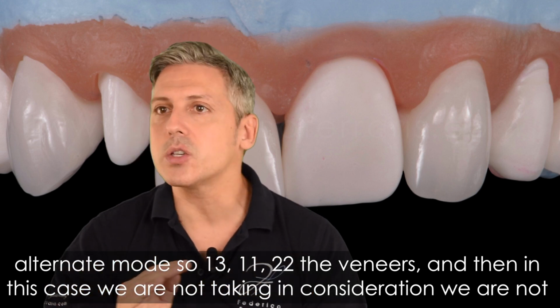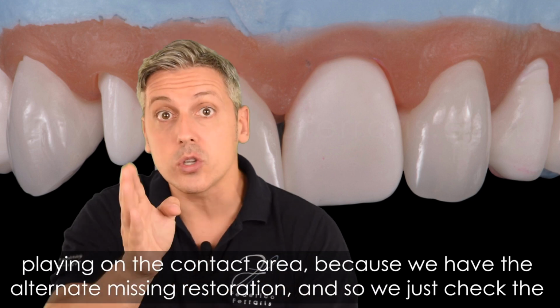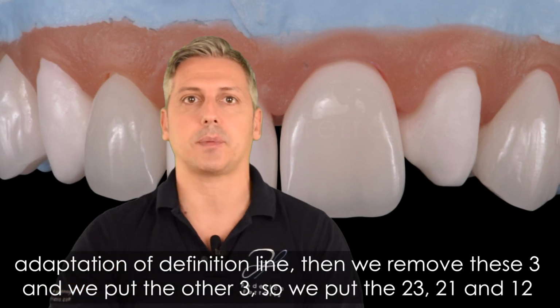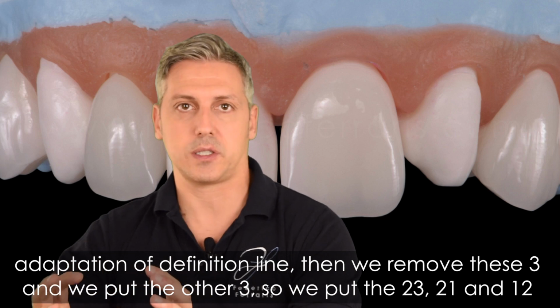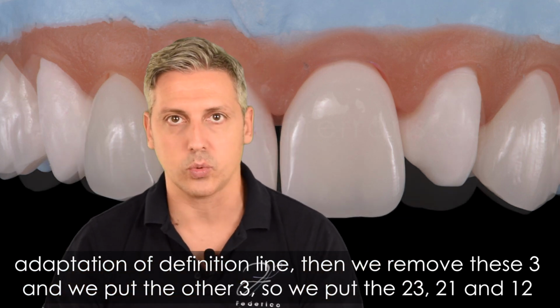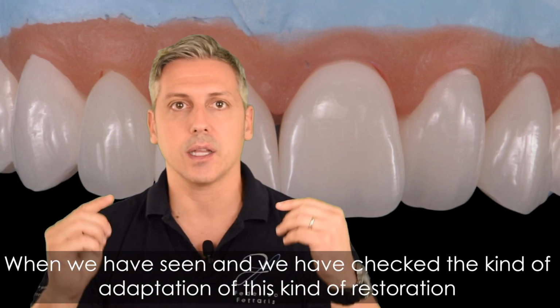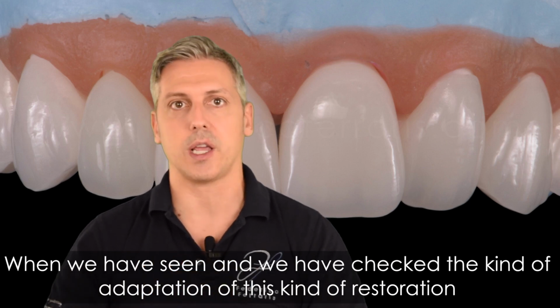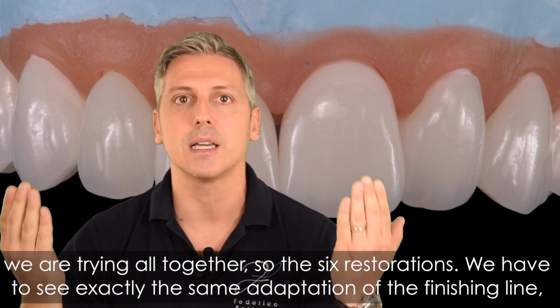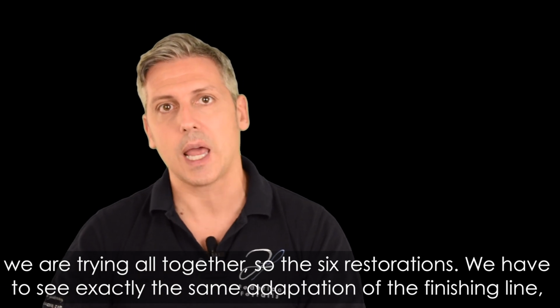In this case we are not taking the contact area into consideration, because we have the alternate restoration missing, and so we just check the adaptation of the finishing line. Then we remove these 3 and we put the other 3, so we put the 23, 21, and 12. When we have checked the adaptation of these restorations, we try all 6 restorations together. We have to see exactly the same adaptation to the finishing line.